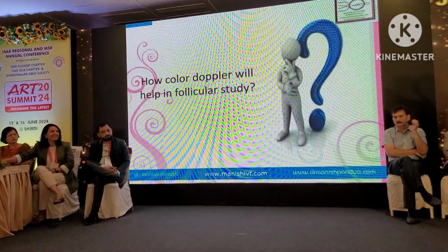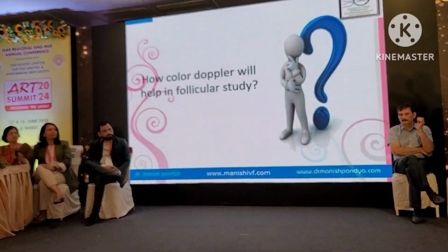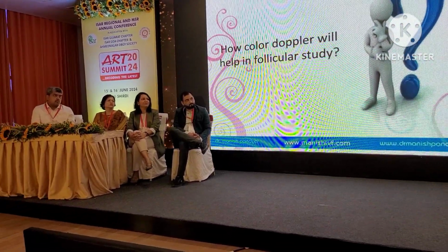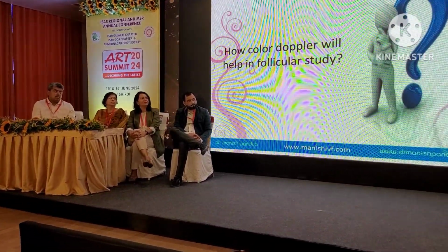That's why this patient is there. There is a cutoff of 3. If it is less than 3, 2.7, or a cutoff of 3, it should be less than 3. Less than 3 means it is 2.7, 2.9, 2.8, but if it is 2.5, then we are happy.